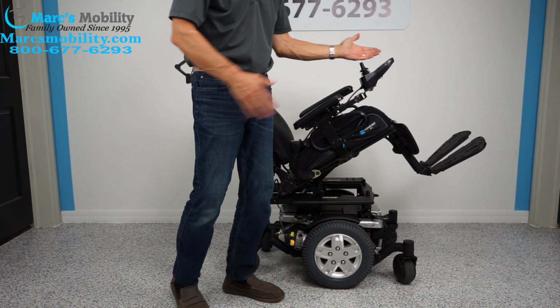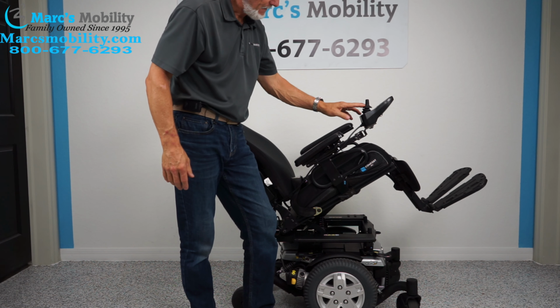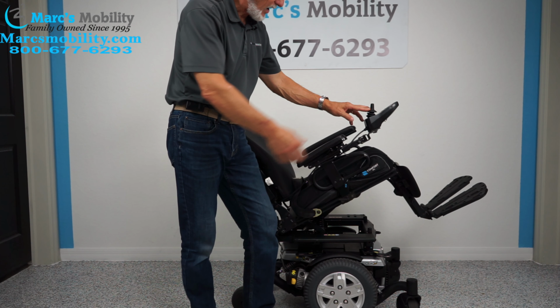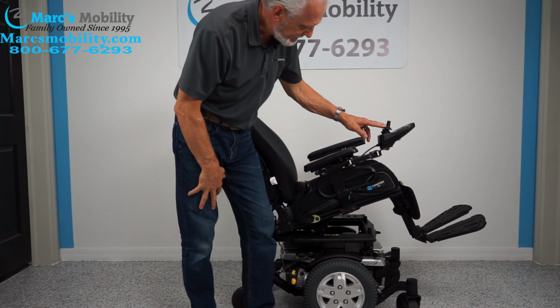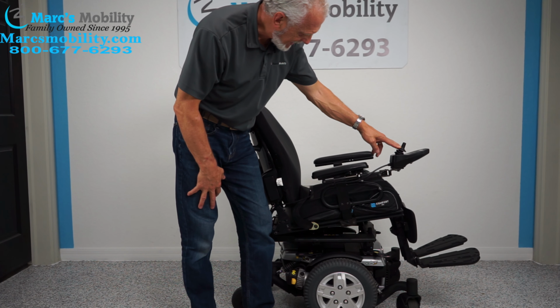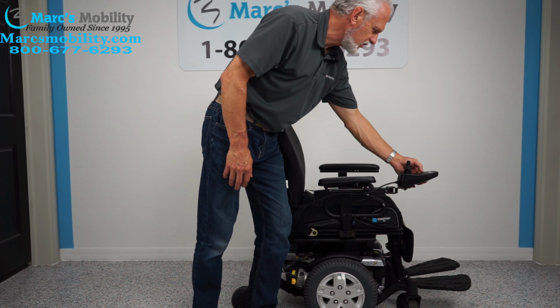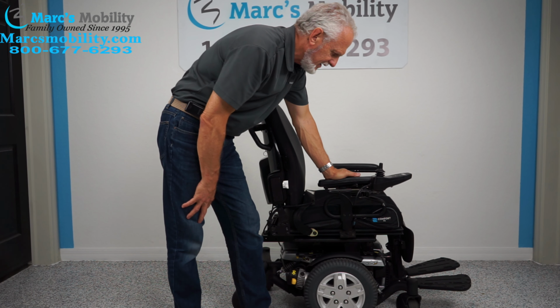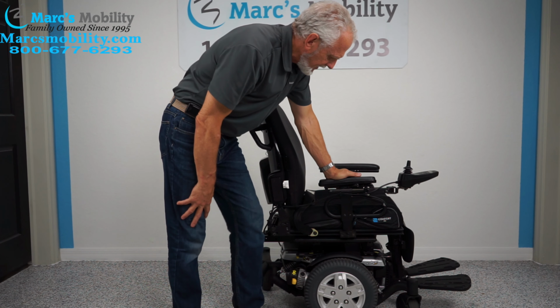Okay? So now after you've done that, if you want to drive again, you have to hit the blue button until you go to your speeds. Okay? Before you do that, you got to bring the seat down. So now we're going to bring the seat down before we go into drive mode. You can't drive with the seat tilted. It won't let you go there, which is probably a good safety feature. So here we go. We're all the way down almost. There we go. Now I'm going to hit the blue button, and we're back into speed number 4. This also has what's called a swing away joystick. It doesn't move that far back, but it does take away about 5-6 inches. Okay, it's called a swing away joystick.